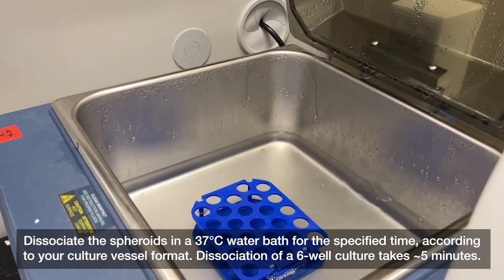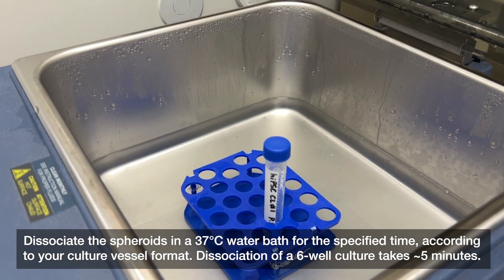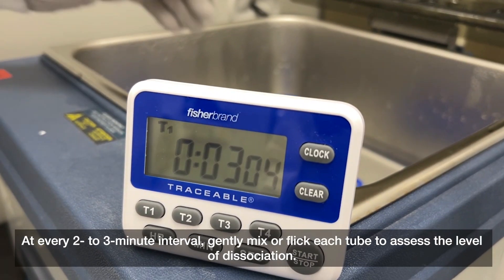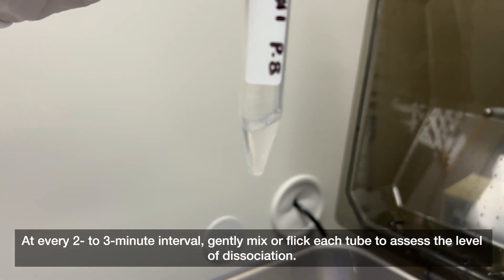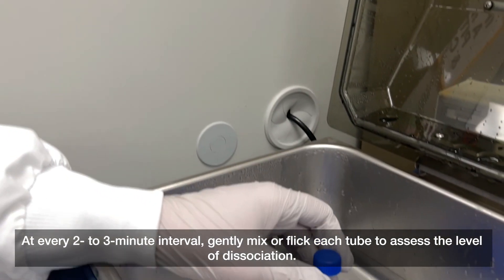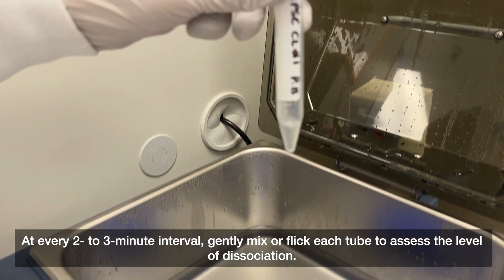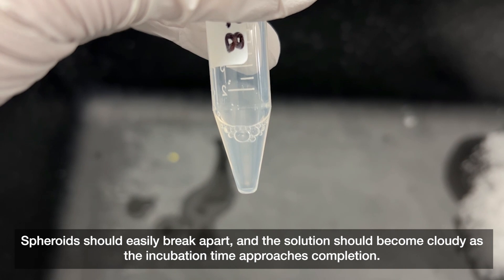Dissociate the spheroids in a 37 degrees Celsius water bath for the specified time according to your culture vessel format. Dissociation of a six-well culture takes about five minutes. At every two to three minute interval, gently mix or flick each tube to assess the level of dissociation. Spheroids should easily break apart and the solution should become cloudy as the incubation time approaches completion.